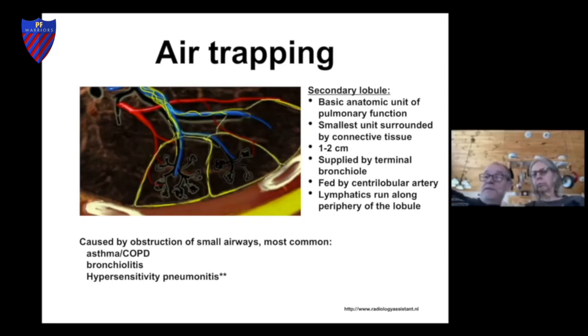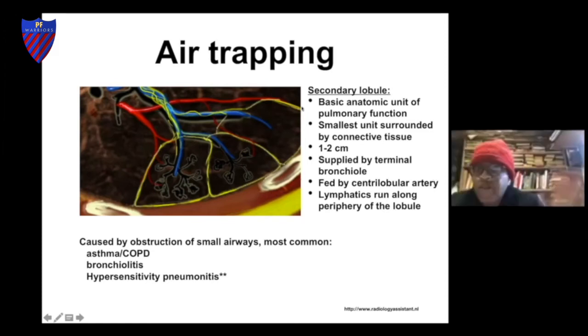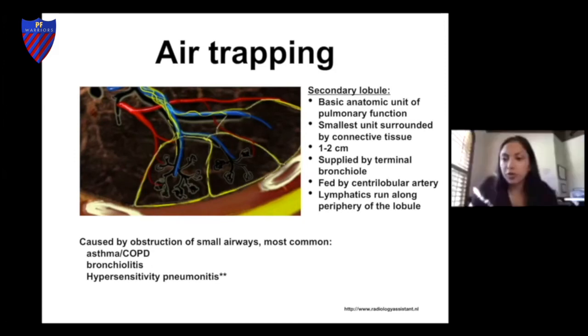I think there's another question, I can't tell the names, but there's a hand up. Good morning, everyone. I was just wondering, is the air trapping pattern on the screen the same as something called mosaic attenuation? Mosaic attenuation can suggest air trapping.